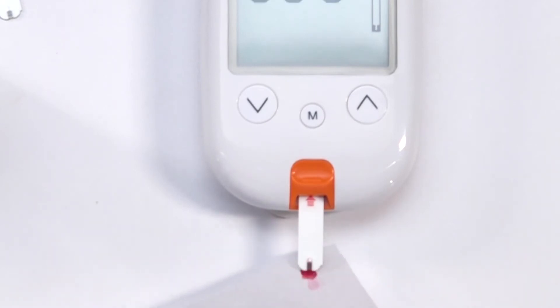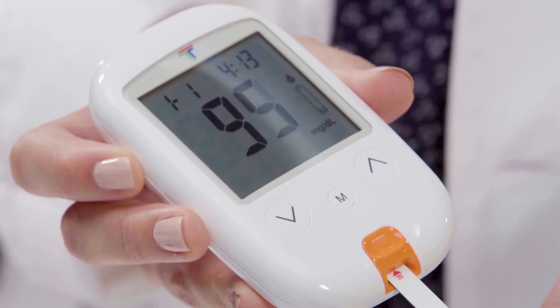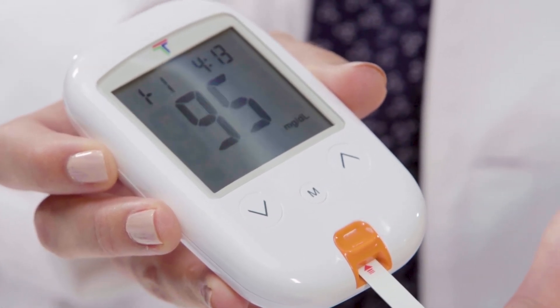The solution will be automatically drawn into the strip. Hold until the meter beeps. The meter will now start to count down and the control solution test result will appear on the screen.